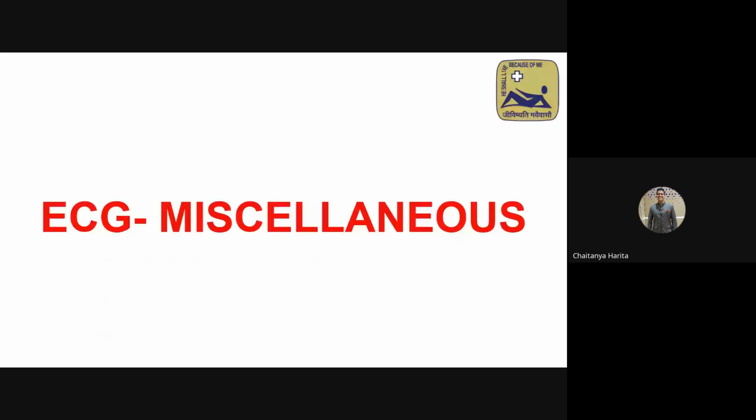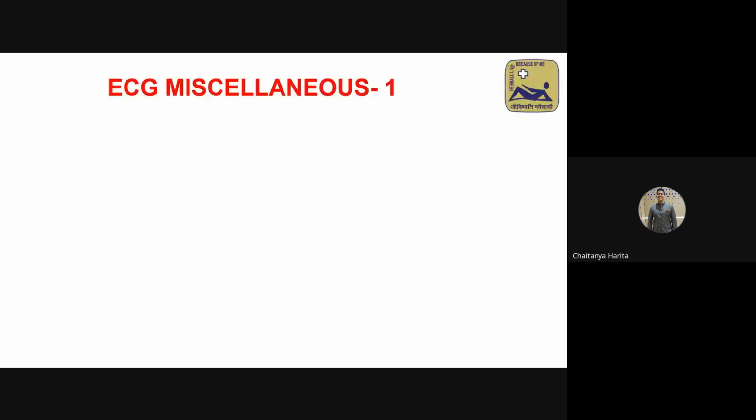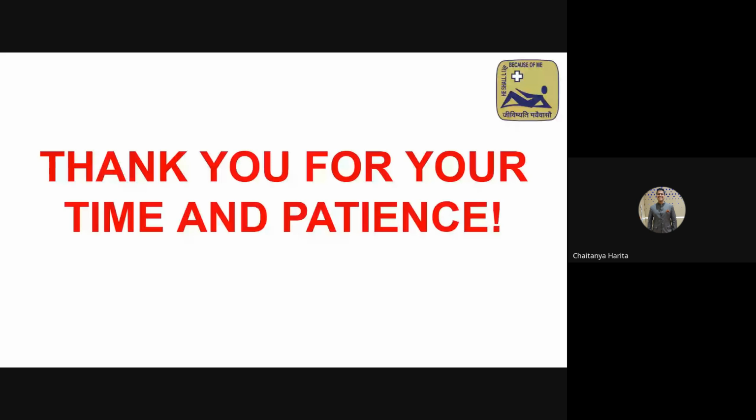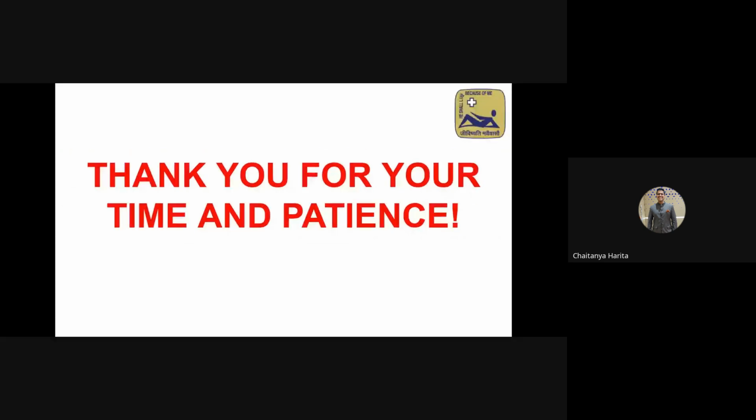Okay. So there are some miscellaneous ECGs which I will skip because I'd like to discuss some of the ECGs that people have put up. So this is about bradyarrhythmias, tachyarrhythmias, and ECGs in ACS. Over to you, Navita.